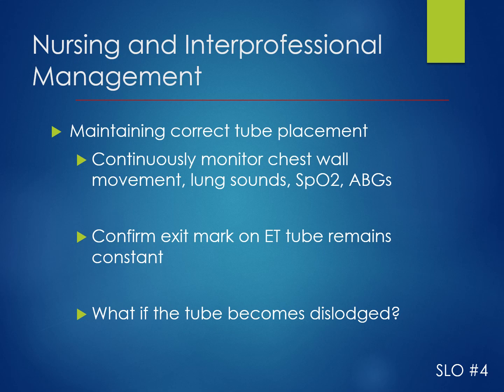But if the tube does become dislodged, we want to make sure we stay with the patient and maintain the airway. So we're going to be giving them breaths with the 100% O2 with that bag valve mask, calling for help immediately. Do not attempt to reinsert the tube. It's almost like a respiratory code type situation.